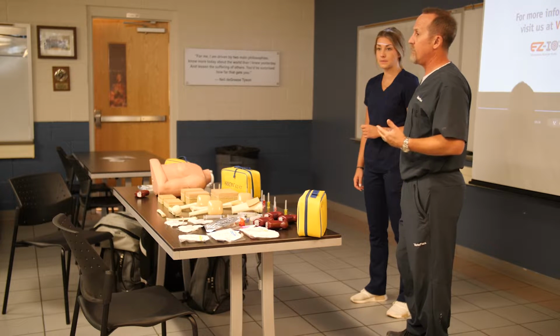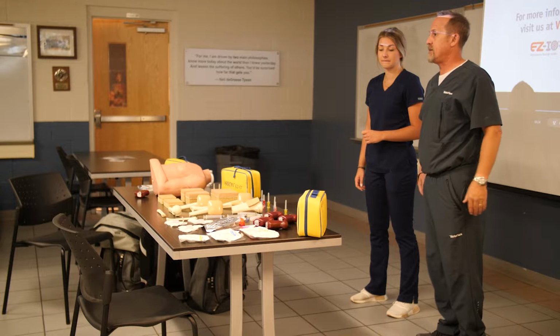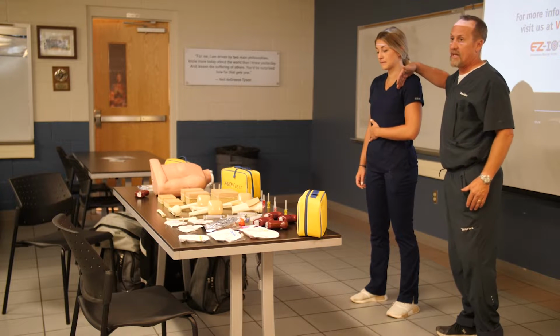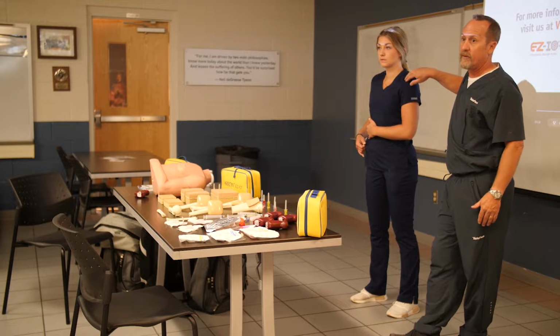So the most important thing we want to do is try to get that biceps tendon out of the way before we place this needle. We achieve that in 2 different ways. Number one, we can put the patient's arm right across their belly, and that rolls that tendon right into their axilla, so it's out of the way. So all we have here is soft tissue and bone, okay?